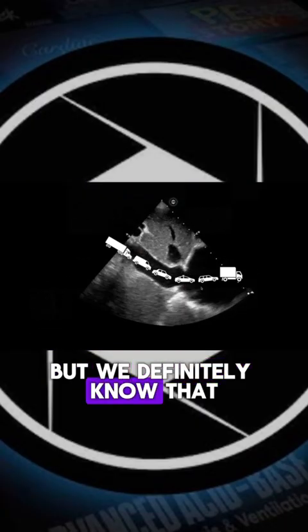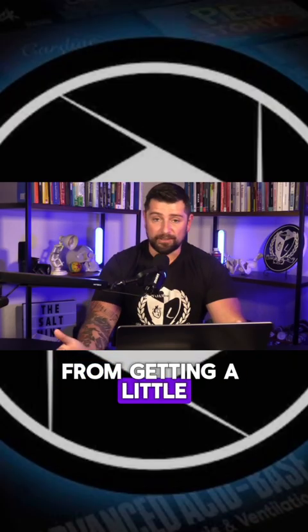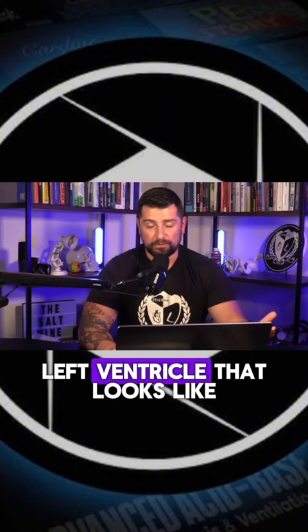But we definitely know that this patient's probably not going to benefit from getting a little bit of fluid. We'll talk about one caveat to that, but they're typically not going to benefit from that. You may have a left ventricle that looks like if I gave that more fluid, it would eject more fluid, but the right ventricle is dilated out. It's huge. It's got a ton of residual volume in it at the end of systole.